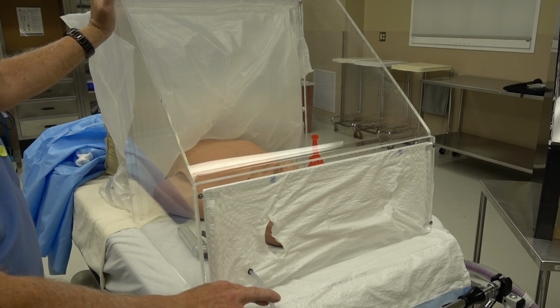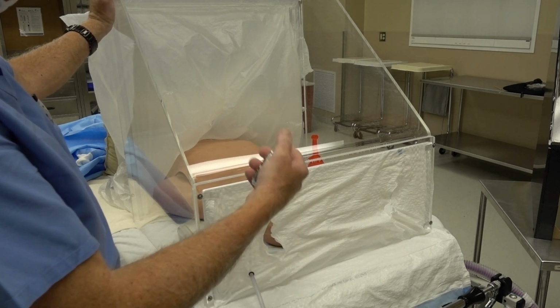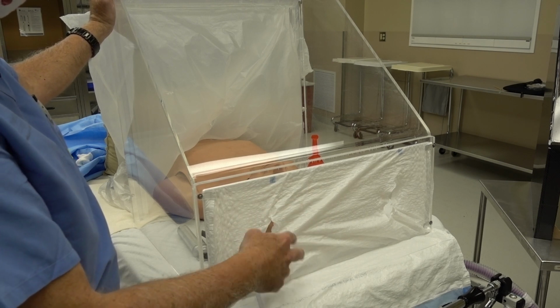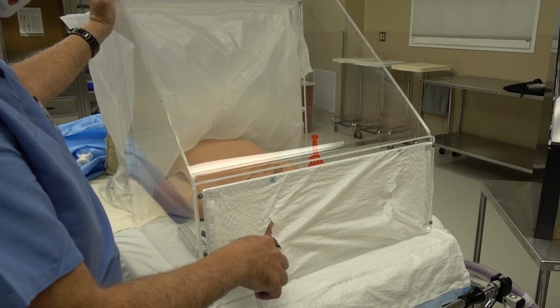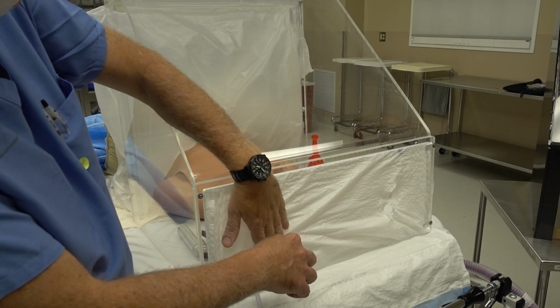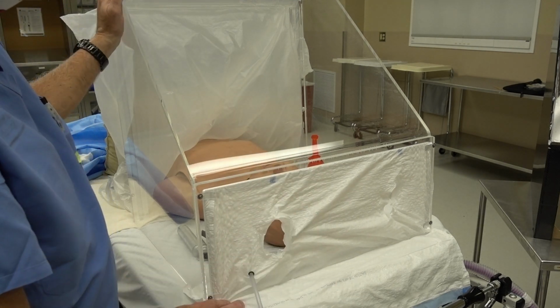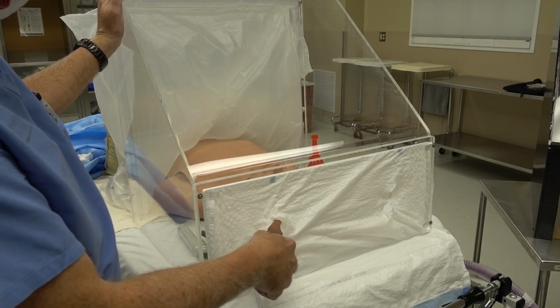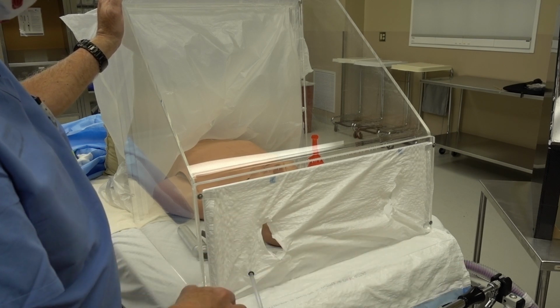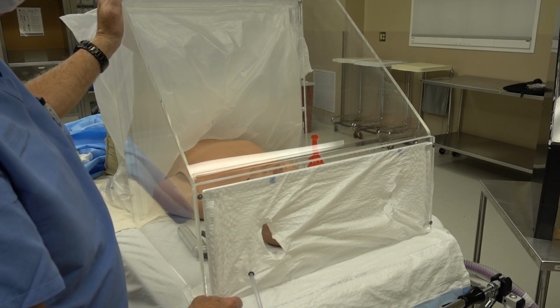Again, you're under negative pressure. These will be sealed off. And again, you could use anything. We used funnels that were inexpensive. Pull them through, take them off, and you got it. But again, we're working on some magnetic discs that'll be flat, won't take up space. You pull them up and clamp it on like that, and you would be able to pull it off and actually re-enter the chamber if you needed to adjust things. The funnels you can tape off, and you can untape them again if you use a half or 1 inch paper tape. They come off quite easily, but they do seal well.